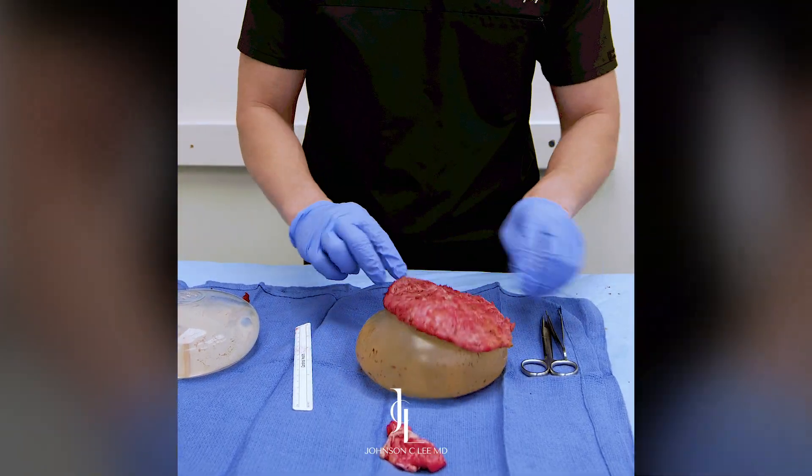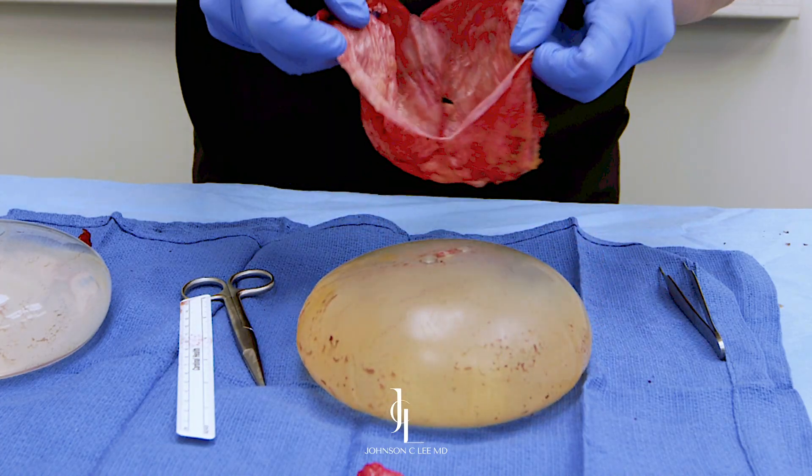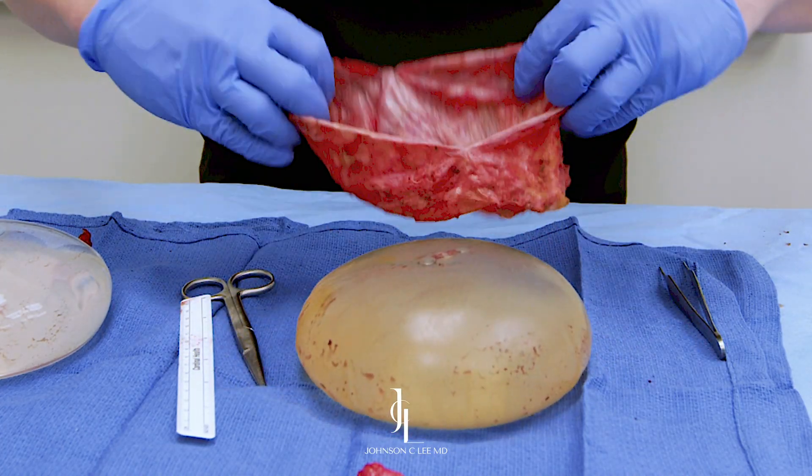The implant was inside the capsule. I'm going to cut open the capsule. And you can see on the inside, this is what it looks like — it was covering the implant the entire time.